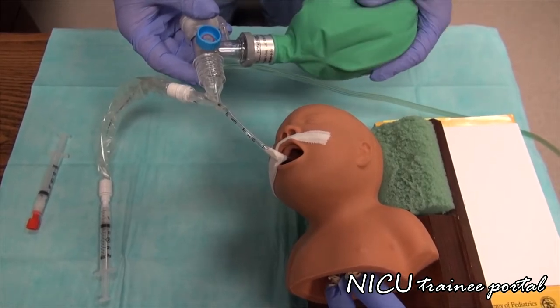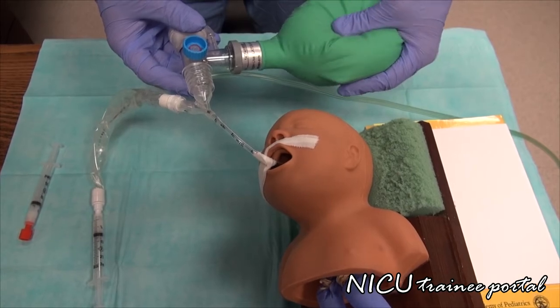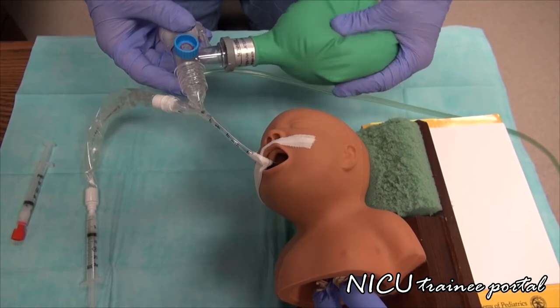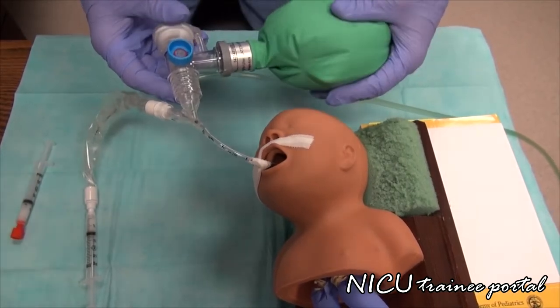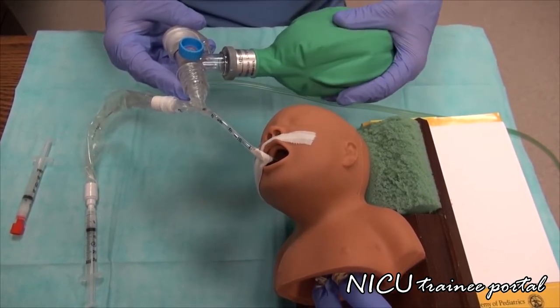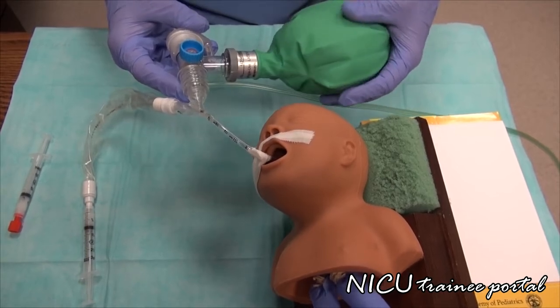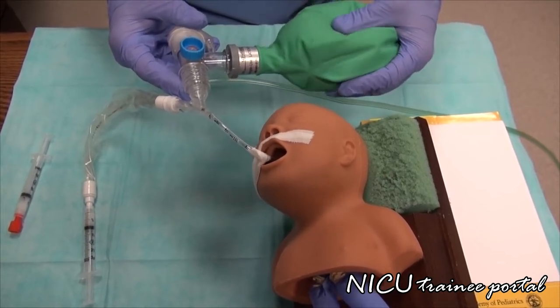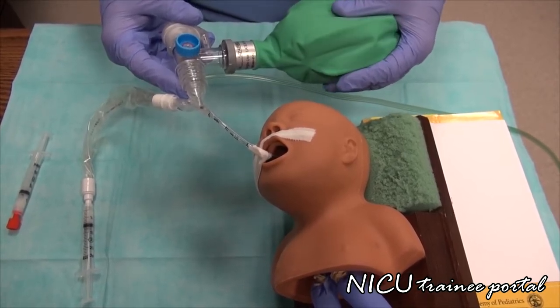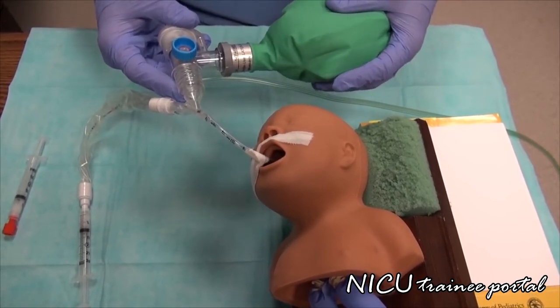When you are done administering your first aliquot, remove the catheter like so, and then begin your bagging again at around 40 to 60 breaths per minute. During the administration of the surfactant, you might get some of the surfactant coming back up the tube. That's when you want to continue bagging the patient through the procedure, making sure that the surfactant stays going down the tube, not up the tube.